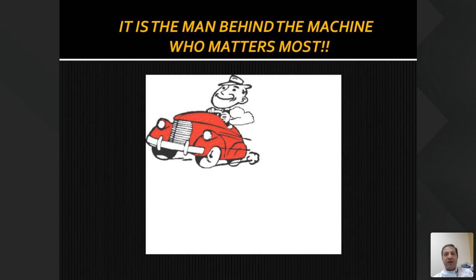But there is one very interesting thing which happens because of the malarial flagging. The moment you get a malaria flag and you validate it on the smear, subsequently your monitoring of the patient can be done on the machine itself, because that will give you an idea of how the parasites are going down in terms of percentages. So it is a very good flag, and yet it needs to be validated by looking at the smear.